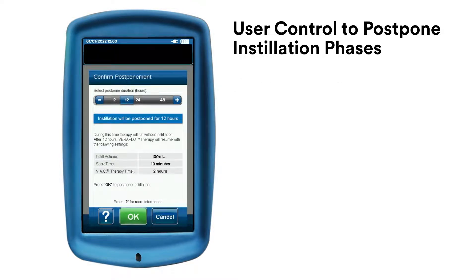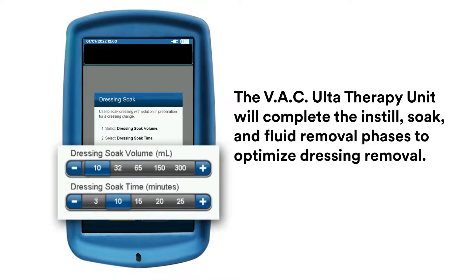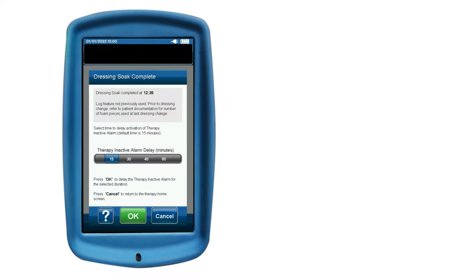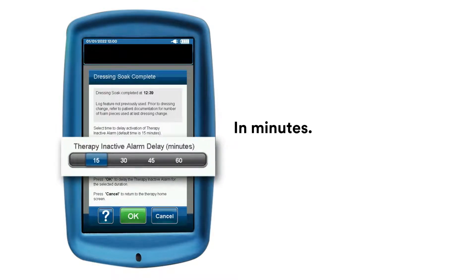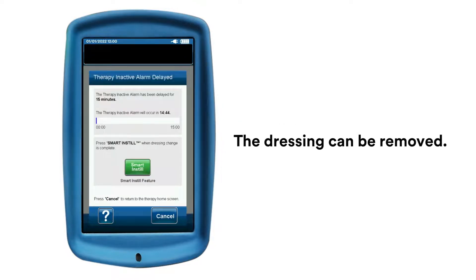VeriFlow Therapy will automatically resume once the selected duration has elapsed. You can temporarily delay the Therapy Inactive Alarm Timer to accommodate patient management tasks such as dressing changes. Select the Dressing Soak feature from the home screen or utilities while therapy is idle. Confirm the desired Dressing Soak parameters during dressing removal and hit OK. Once the Dressing Soak fluid removal phase is complete, select the length of time to delay the Therapy Inactive Alarm in minutes and select OK to continue. The dressing can then be removed.